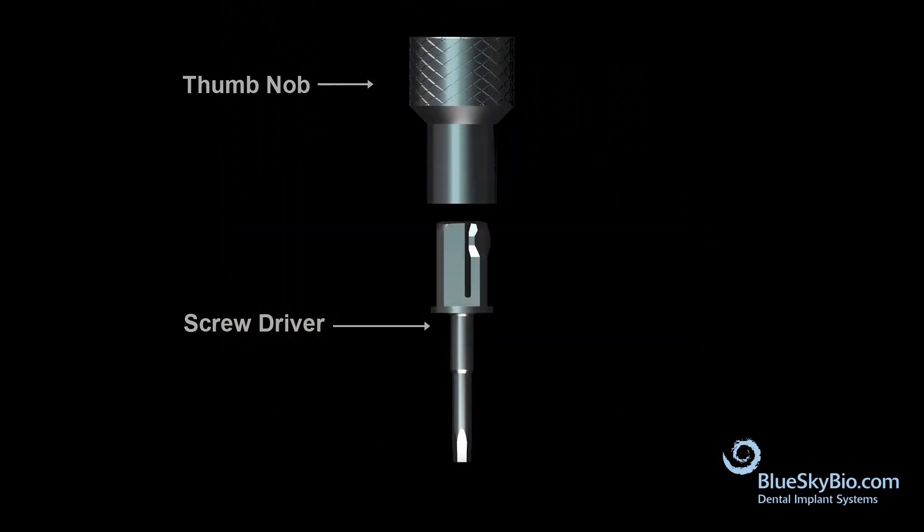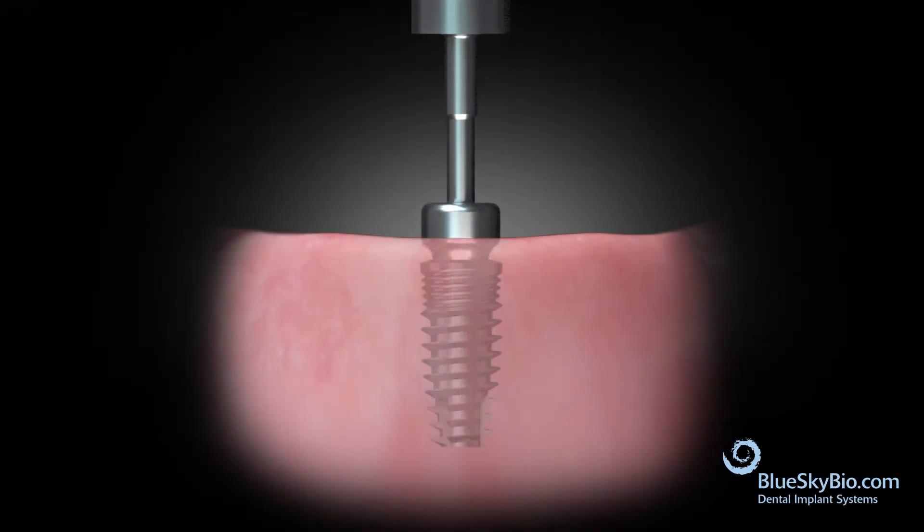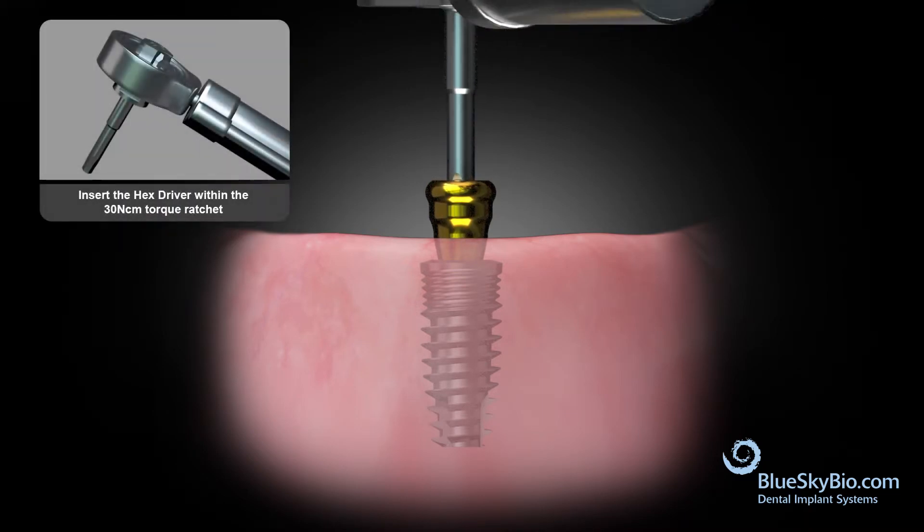Connect the thumb knob to the screwdriver and remove the healing abutments. Insert the abutment into the implant. Tighten the abutment first with finger pressure, then insert the driver into the wrench and torque to 30 N·cm.